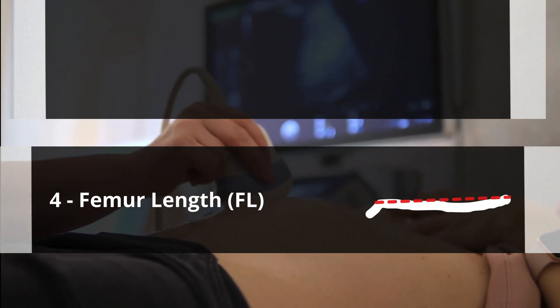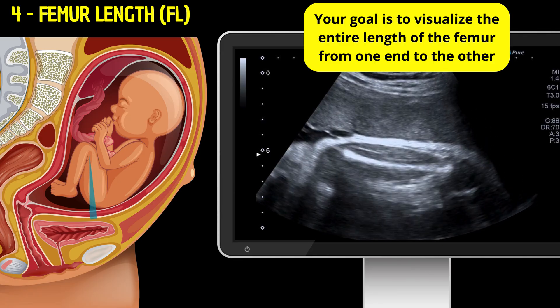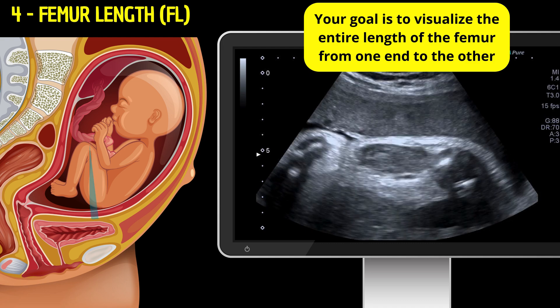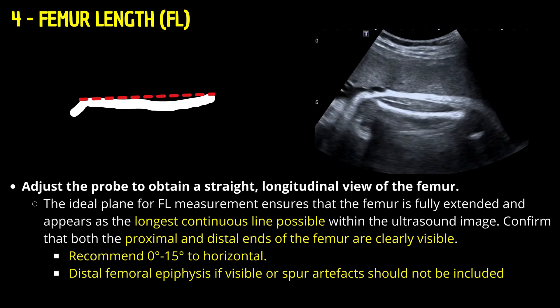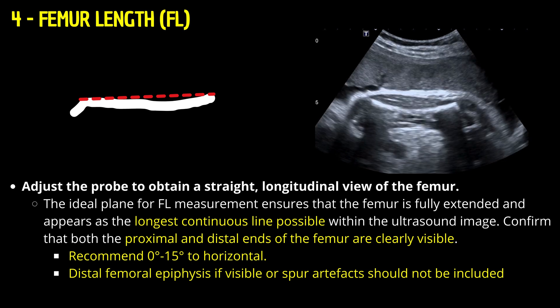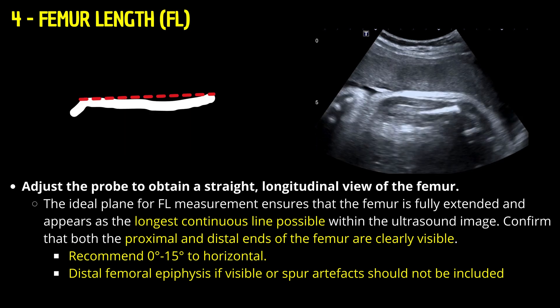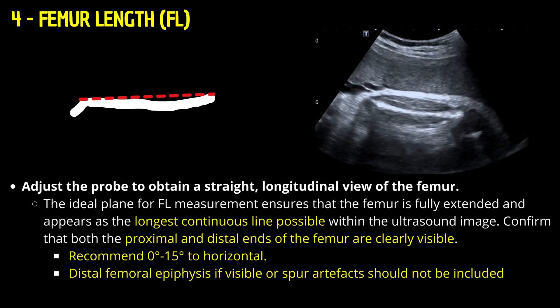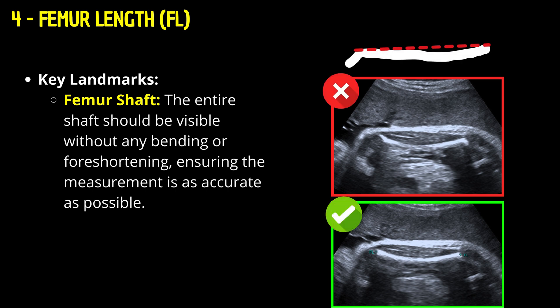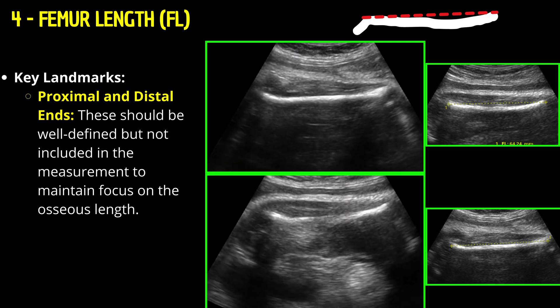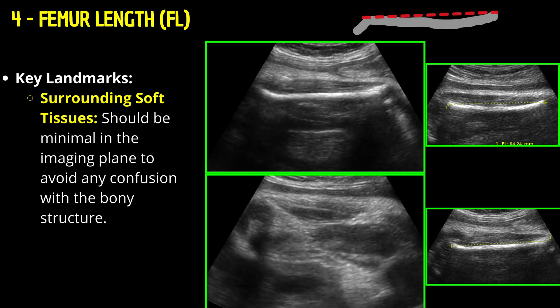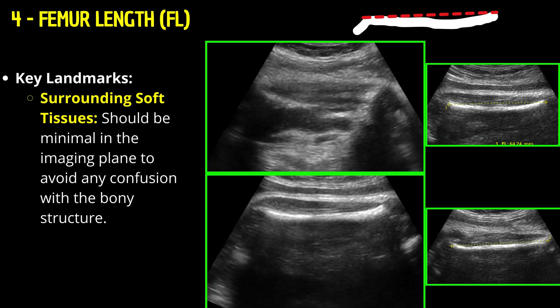Femur length — positioning the probe: Place the probe longitudinally along the mother's thigh line, targeting the fetus's femur. The goal is to visualize the entire length of the femur from one end to the other. Adjust the probe to obtain a straight longitudinal view, ensuring the femur is fully extended and appears as the longest continuous line possible. Confirm that both the proximal and distal ends of the femur are clearly visible. The entire femur shaft should be visible without any bending or foreshortening. The proximal and distal ends should be well-defined but not included in the measurement, maintaining focus on the osseous length. Surrounding soft tissues should be minimal in the imaging plane to avoid confusion with the bony structure.